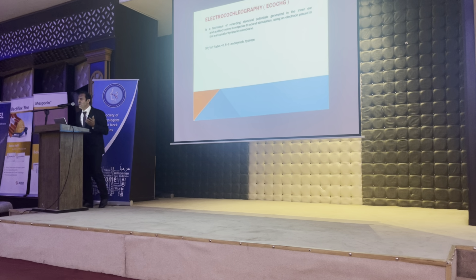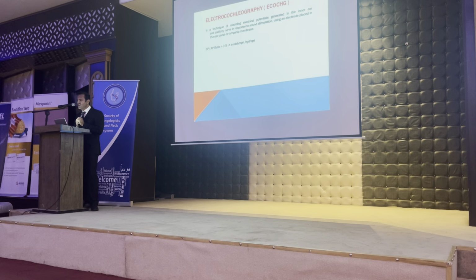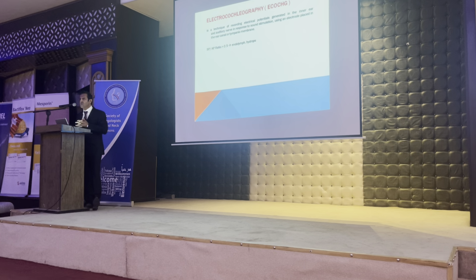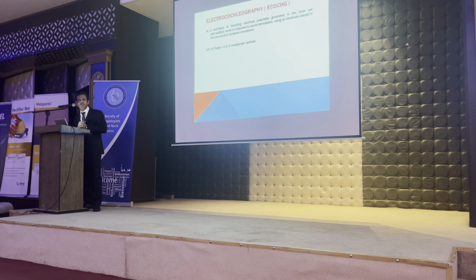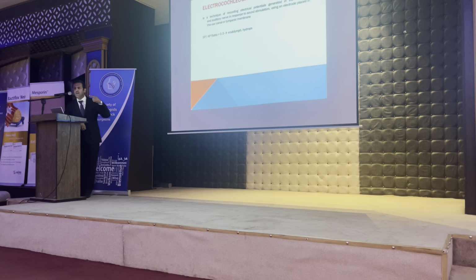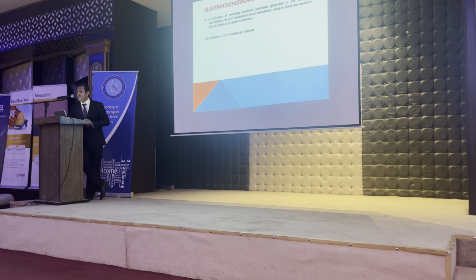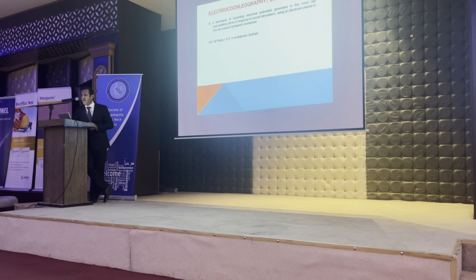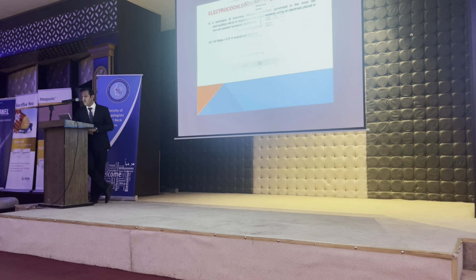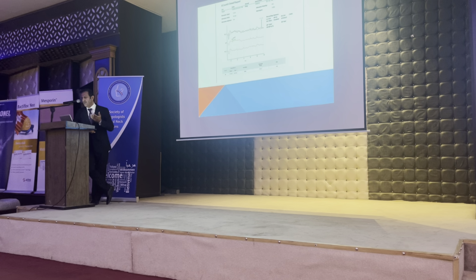Now, electrocochleography. As you know, it is a recording of the SP/AP potential, and there is intratympanic, which is invasive, and extratympanic, which is non-invasive. Nowadays, we don't recommend going for the invasive procedure. You can use extratympanic gold foil tips over the surface of the tympanic membrane. In this case, when the ratio is more than 0.5, it is highly suggestive of endolymphatic hydrops. And this is an example of one of my patients with Meniere's disease.